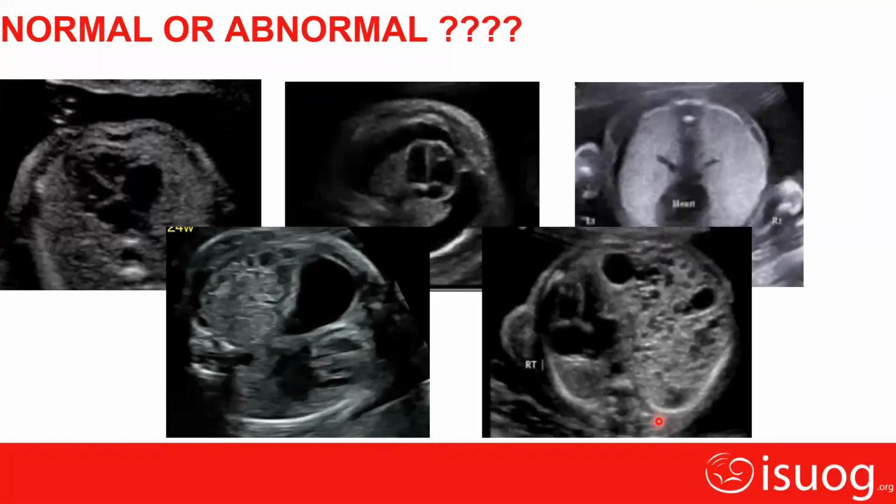Yes, this is CPAM, right, sir? Well said. This is CPAM. The heart is here. This is the lung mass, which is more echogenic, and this is the cystic structure. So this is the CPAM of the lung, which has pushed the heart to the opposite side.